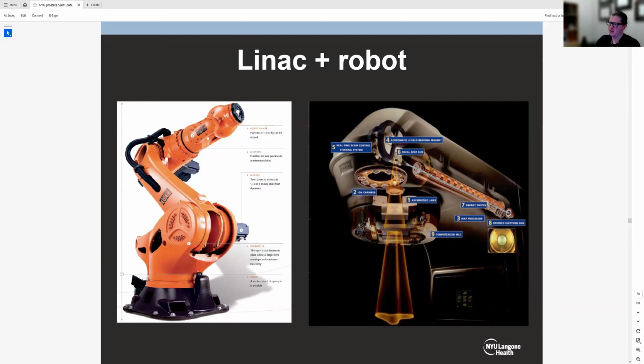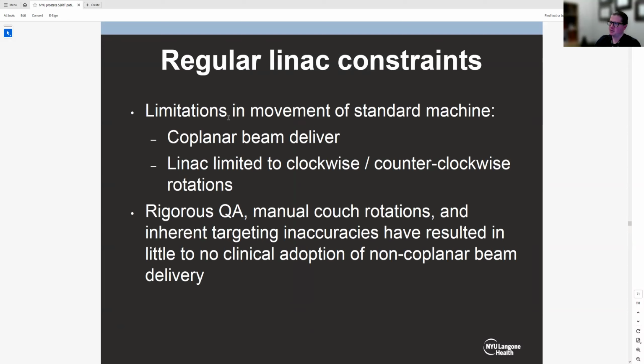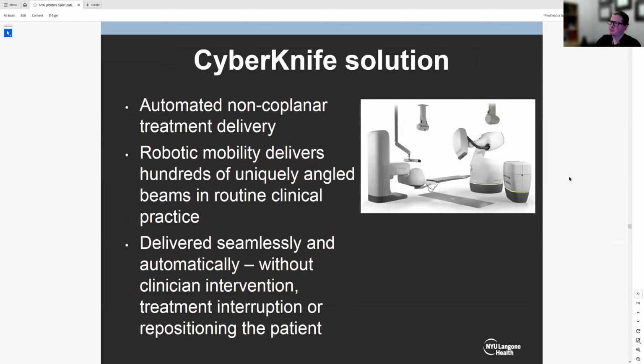And so you put this on top of the end of this robotic arm, and you're able to come in from a variety of different angles and deliver radiation in a very precise arrangement of beams. So you can deliver a lot of different small beams at different angles, what we call non-coplanar, which basically means they can come in from a variety of different angles and all converge on that one spot within the patient's body, to minimize radiation exposure to the surrounding structures and maximize radiation to the tumor. As I said, these can be sometimes hundreds of individual beams coming in and converging on a certain area from a variety of different angles.